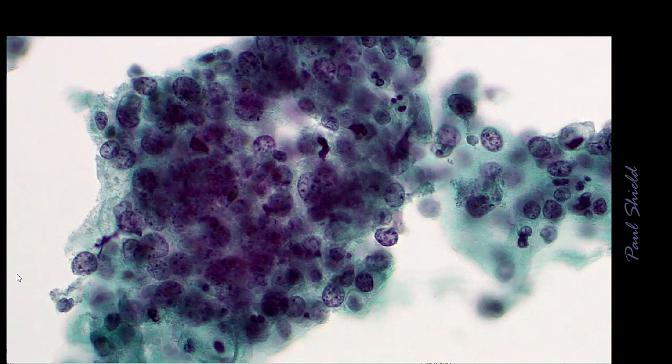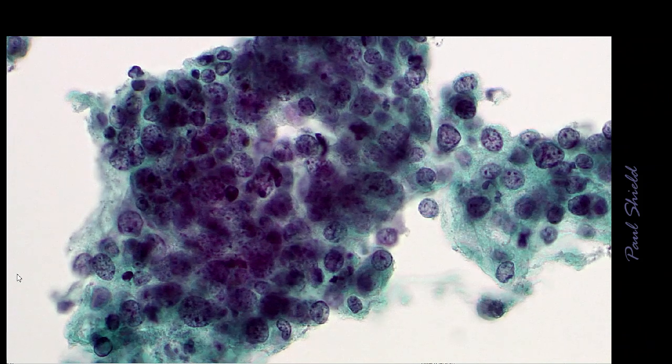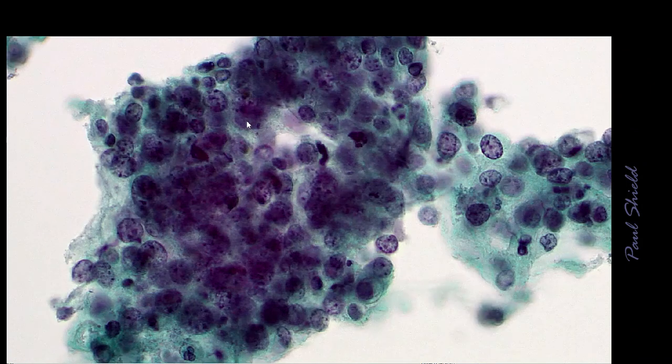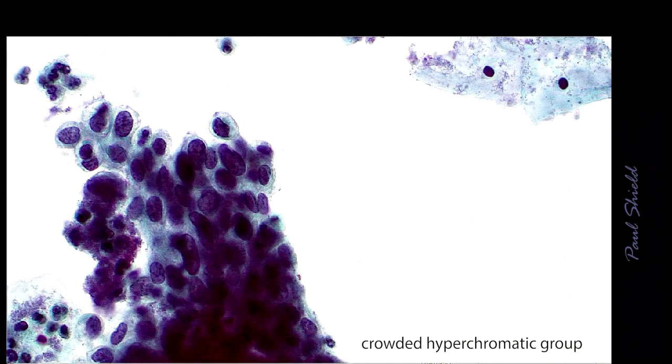And as I do that, you can see how variable the nuclei are. They're all hyperchromatic, but the chromatin pattern on them is varying quite a lot. The size and shape of them. See that one there is quite spotty, like a leopard. And there is very different shapes, like compare just small nuclei to large ones with their neighbours.